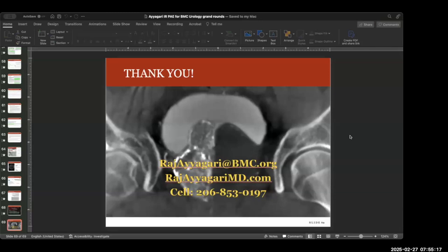Number two, regarding the last case, you say it's better to embolize both sides, but same catheter position. That I did not understand. No, it's not better. In this case, we had to, because on one side the atherosclerotic plaque had closed up the prostatic artery, and so we were able to salvage the situation. We were lucky that one side did end up supplying flow to both the left and the right half of the prostate. When you do that, it's very rare.